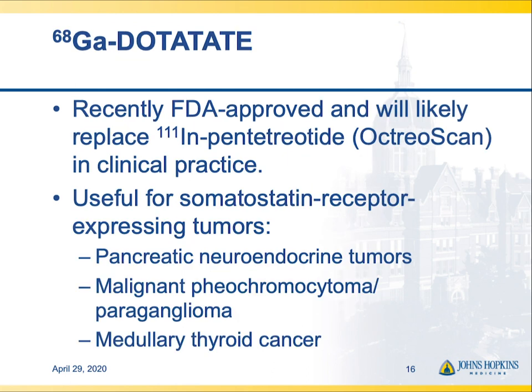And then I do want to talk about gallium dotatate, and I'll spend a few slides on this. This was also FDA approved in 2016, and I would say at this point it has pretty much replaced indium-111 pentetreotide, or Octreoscan, in clinical practice for imaging somatostatin receptor expressing tumors.